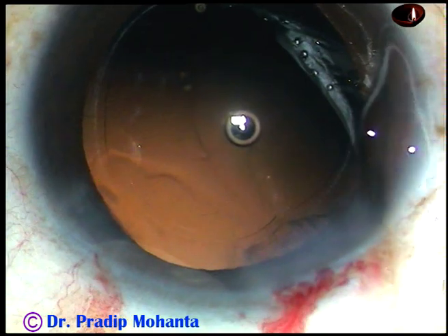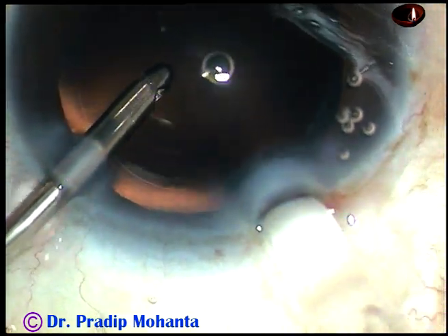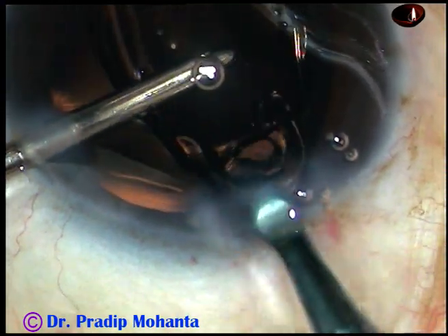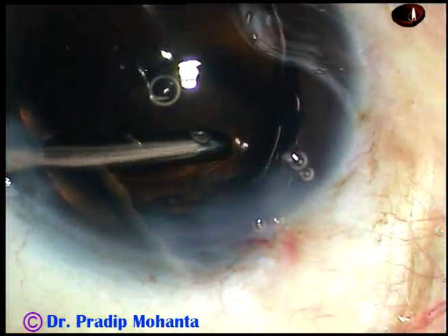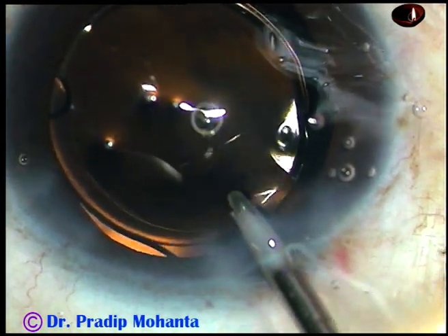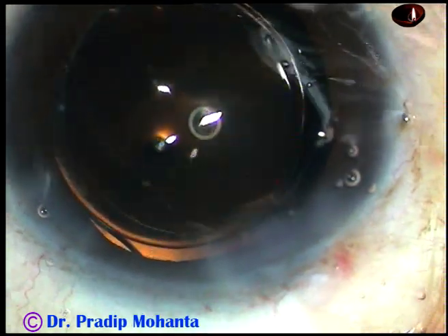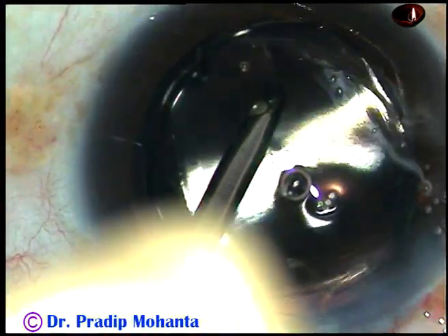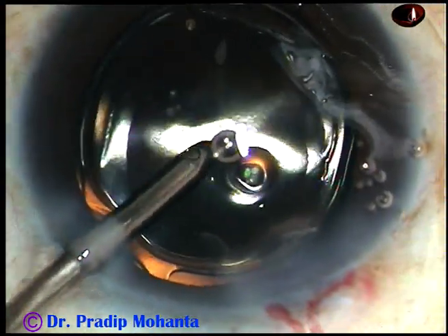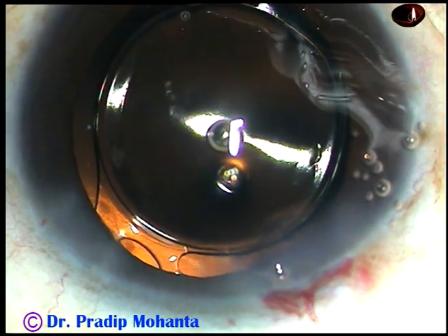And now, hydro implantation. The anterior chamber is formed by the irrigating fluid and here goes the intraocular lens. The leading haptic as well as the tailing haptic goes into the capsular bag by the irrigating probe. In this case, you can see that the leading haptic is still attached to the posterior surface of the optic, and here it gets detached. Now the haptics have taken shelter at the equatorial part of the capsular bag.